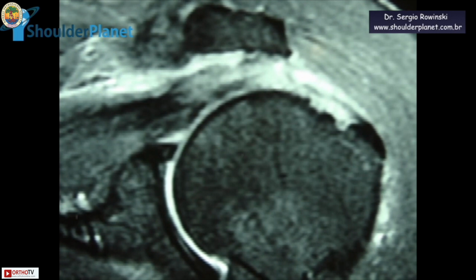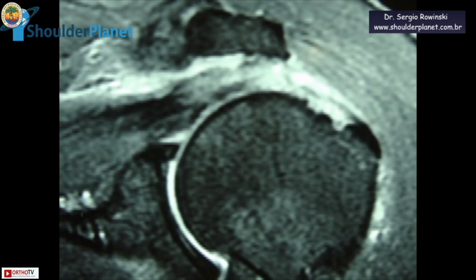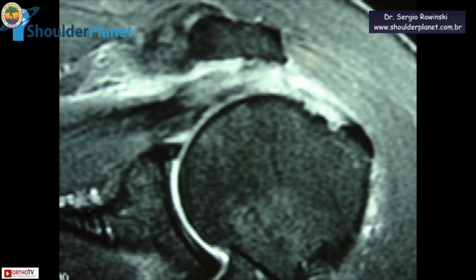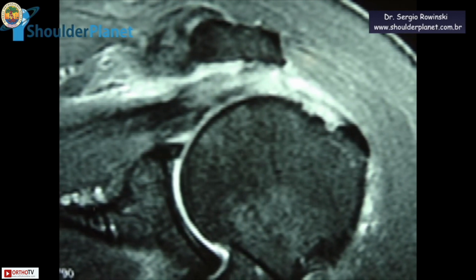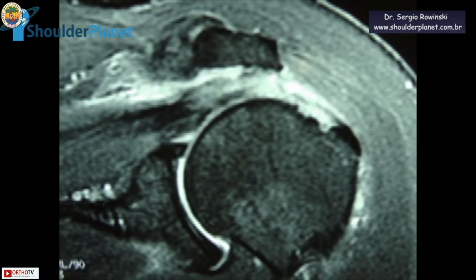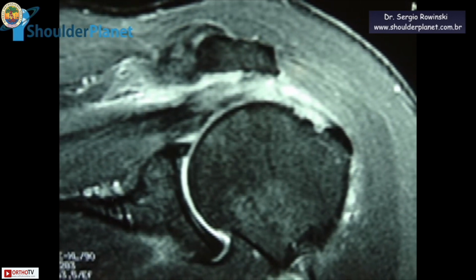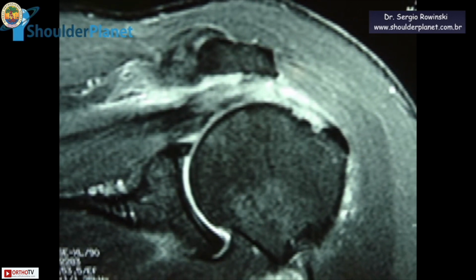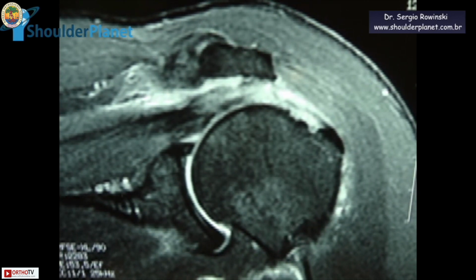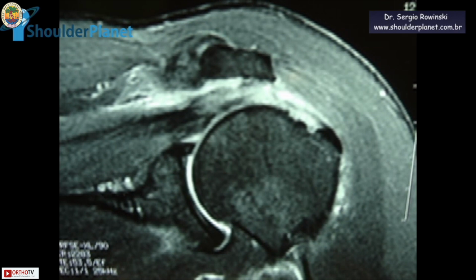Massive rotator cuff lesions are the most difficult kind of lesions to treat, and nowadays we know that there are quite different patterns of massive lesions in the shoulder. In this case, I am presenting a 64-year-old woman who had pain over her left shoulder for the last 3 years, with very typical signs and symptoms of cuff pain.